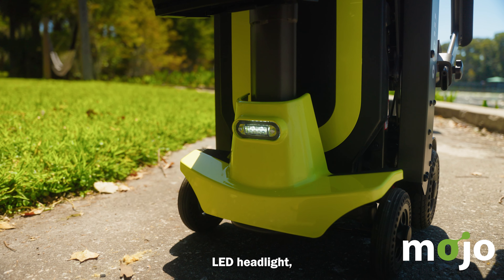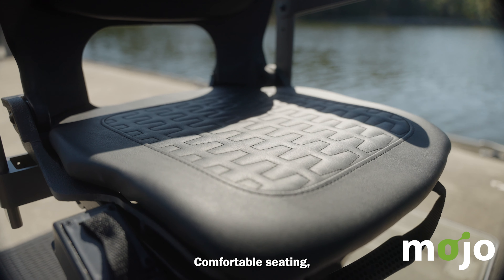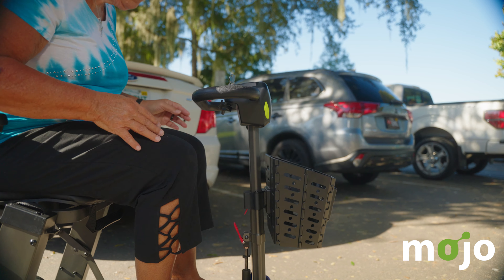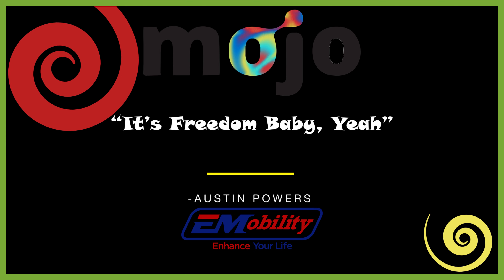Have you lost your Mojo? This all-new scooter is going to help you get your Mojo back. The Mojo is the first and only mobility scooter to combine the ease and convenience of a folding scooter with the option to quickly split the scooter into two smaller pieces for easier and lighter lifting.